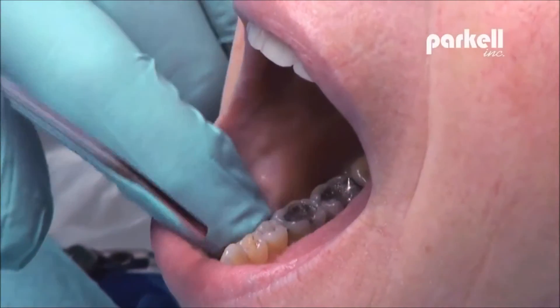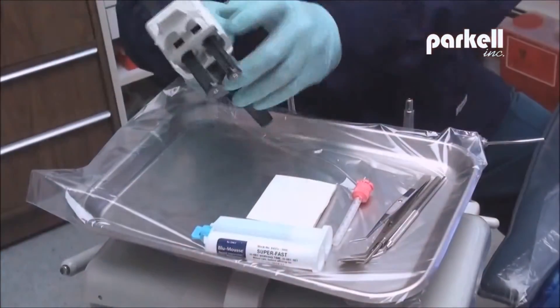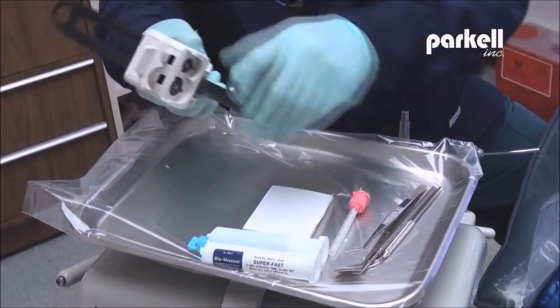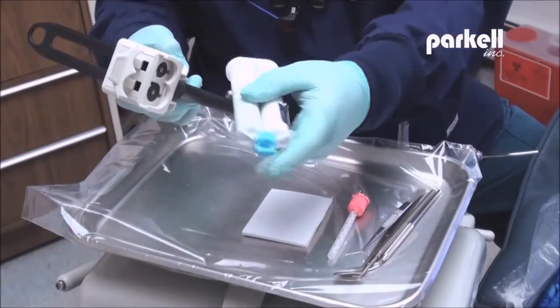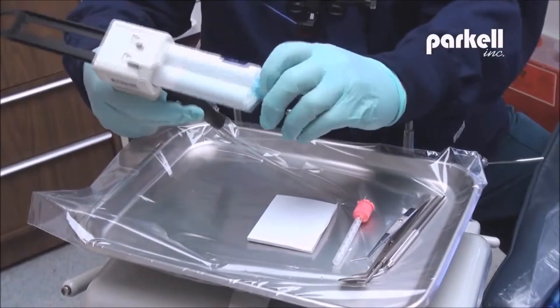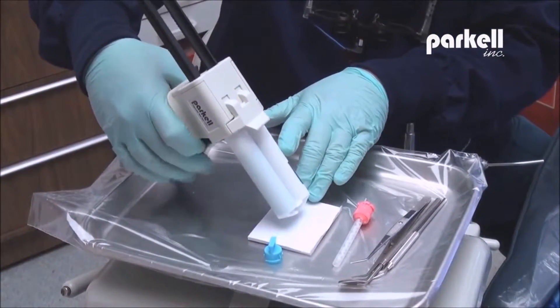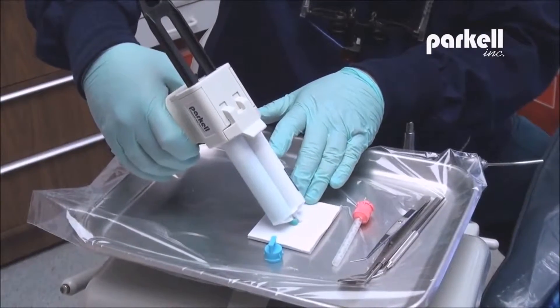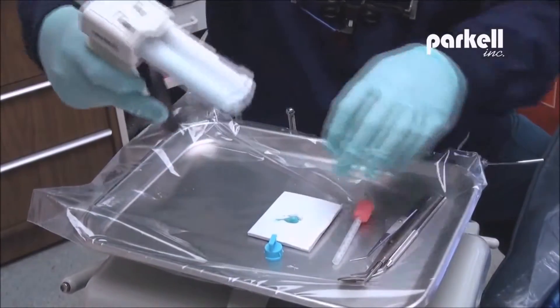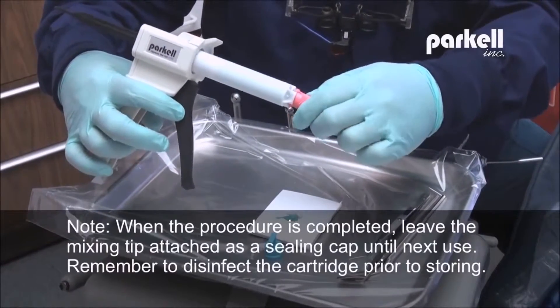Clean and dry working surfaces thoroughly. Insert Blue Moose cartridge into impression gun. Twist off sealing cap and discard. Bleed cartridge onto a mixing pad to discard older residue. Securely attach a new mixing tip and turn clockwise to lock.